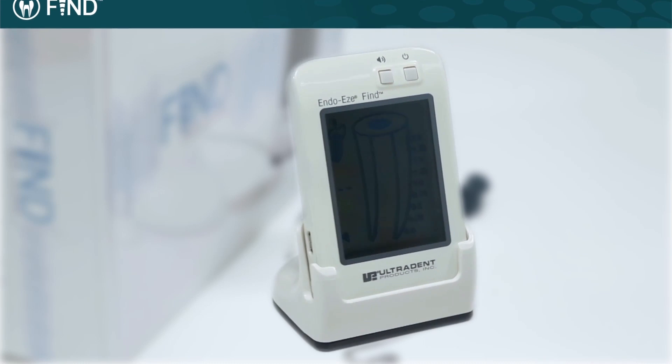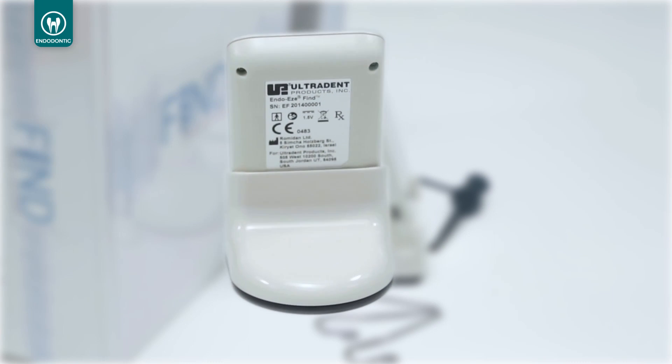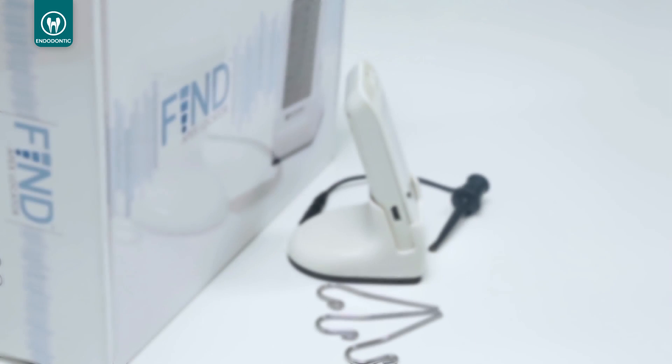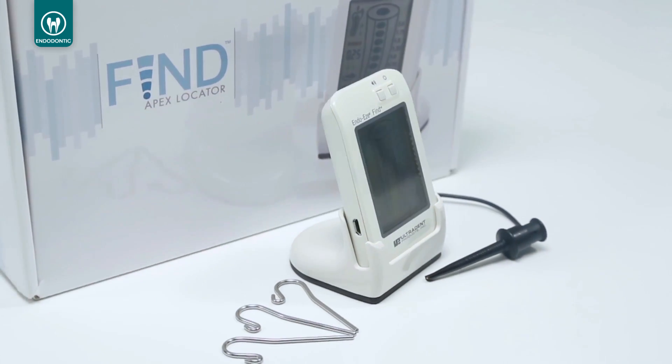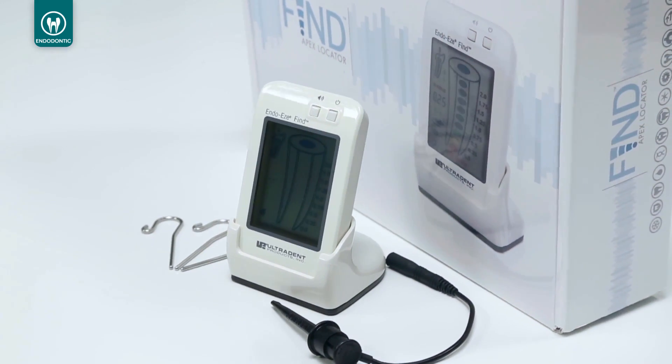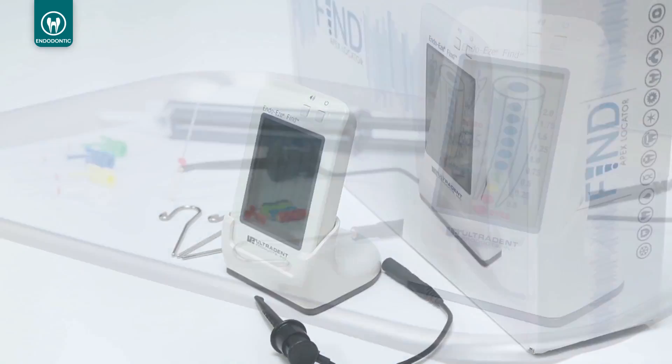The EndoEase Find Apex Locator uses fully automatic, multi-frequency measurements to provide unsurpassed accuracy and reliability with a convenient and easy-to-read display. Its compact design and small footprint allow it to fit easily on a counter or treatment tray.